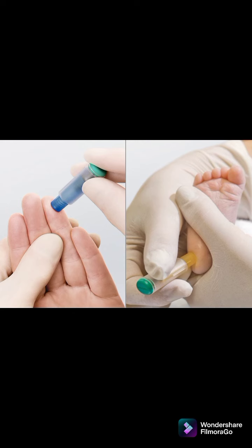Skin puncture sites are the finger for adults and older children and the heel of infants and younger children.